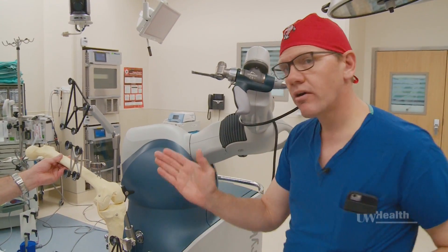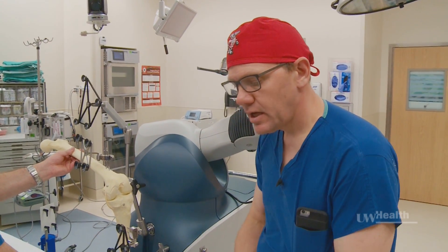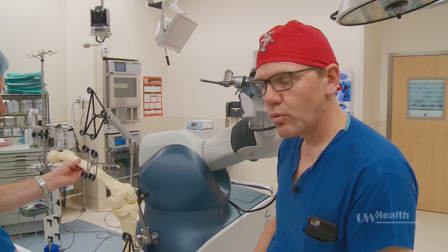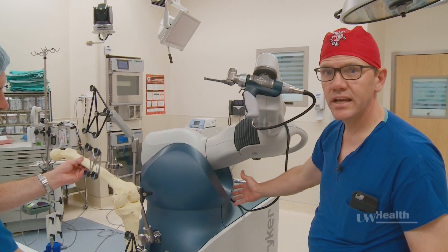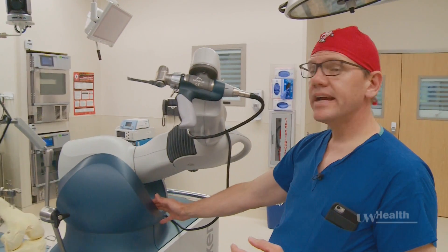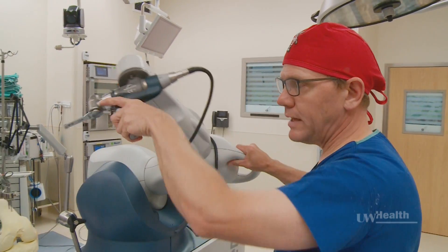So instead of using our eyeballs, our hands, our experience, and tools like this, we're now using a sophisticated robotic assisted device to be able to shape the bone.